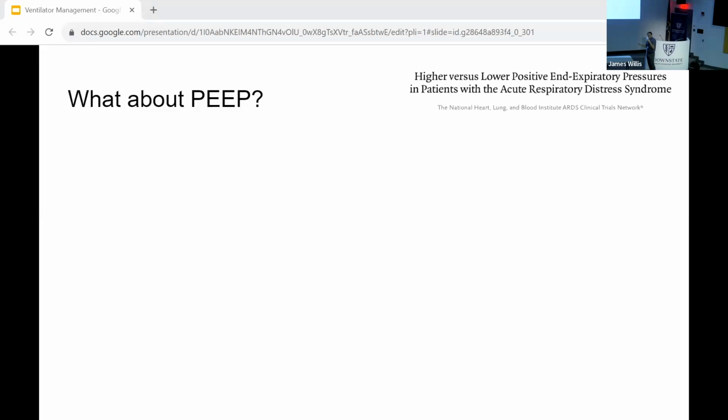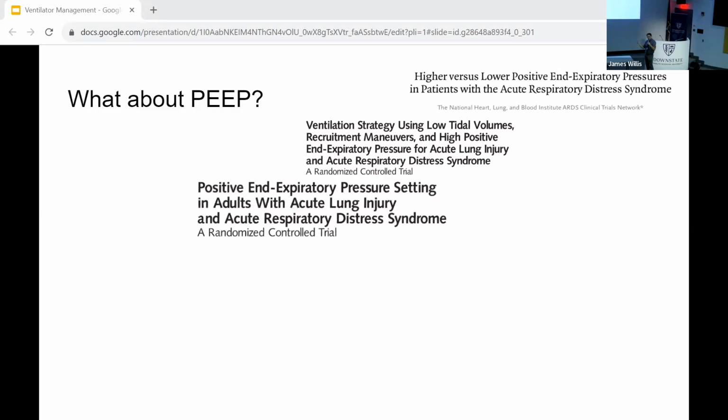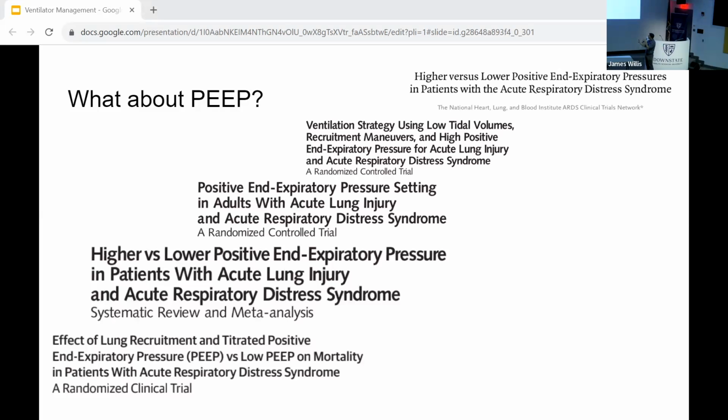And there's all these trials on just that single button, that single dial, PEEP. Look how many trials, and this is just a selection, and I put it on purpose in a staircase format because there's trials on even performing staircase-like PEEP maneuvers on how you should adjust the PEEP. What is the best way? And there are some arguments about what the best way is.